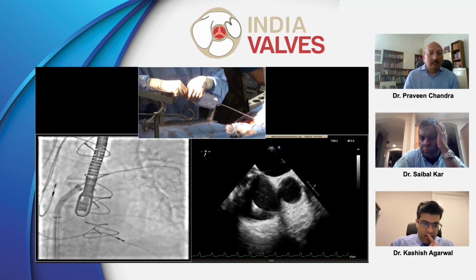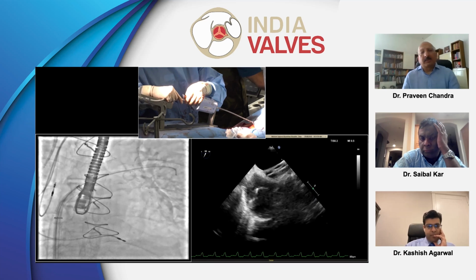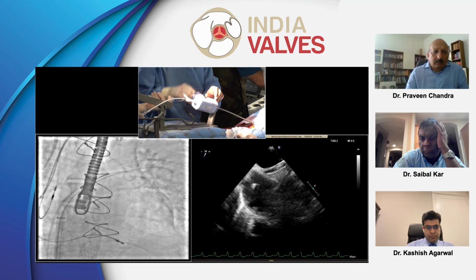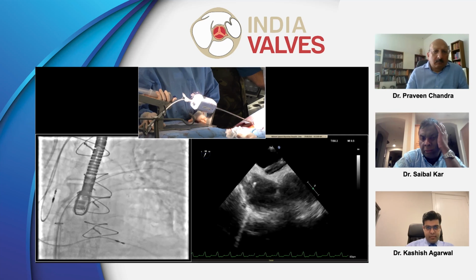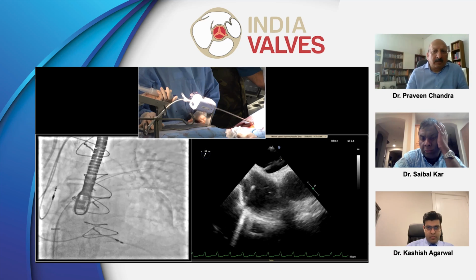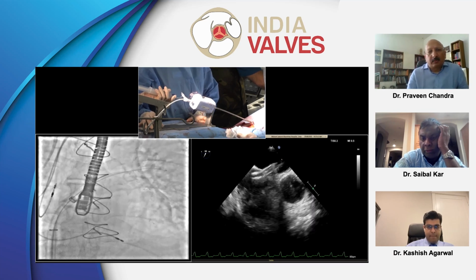Okay, so we're going to dilate. Now the dilator is out. It's still far away. Still quite deep inside. So I pull back the dilator. The wire is still there. Okay, Prashant, measure the guide. Okay, so I'm going to pull back the guide. We are too deep into the LA, so I'm going to pull back. Just focus on the guide. Yes, that's a good view. This is better. Even more. That's all. Okay, measure the guide, please.